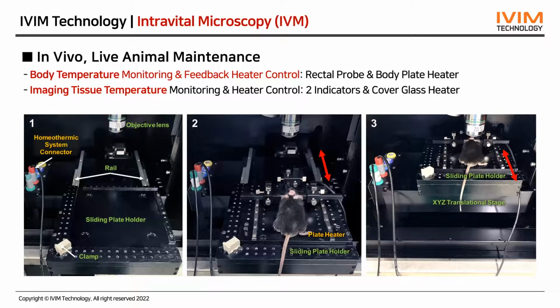This is the translational stage for mounting the mouse model. All accessories are connected to the connector on the left, and we can slide in and out of the stage before and after mounting.